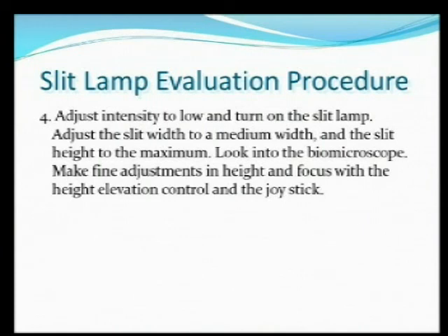Intensity-wise, some slit lamps have a rheostat, some have a low, medium, and high. Keep it down on low. Keep it as comfortable as you can for the patient. Now, if you're using a filter and you need to adjust the intensity a little bit, fine. But for most observations, the low intensity will work as well, as will a medium width beam. Again, you start out with the standard setup. You can always switch to one of those other tools if you need it.